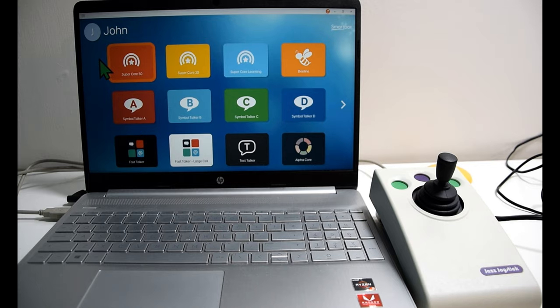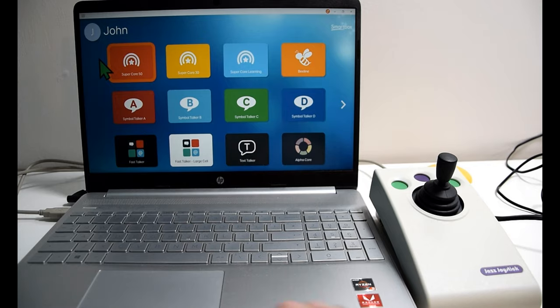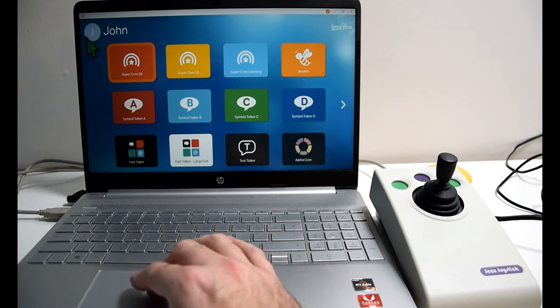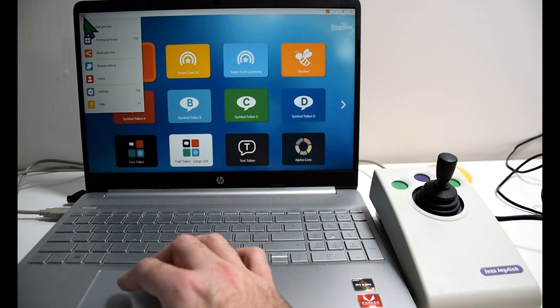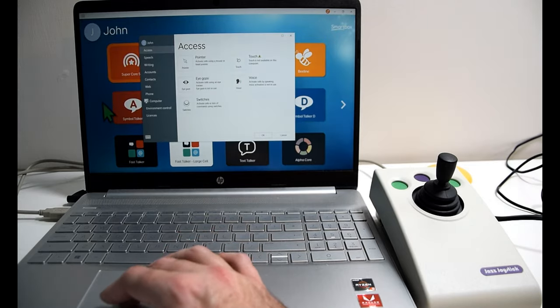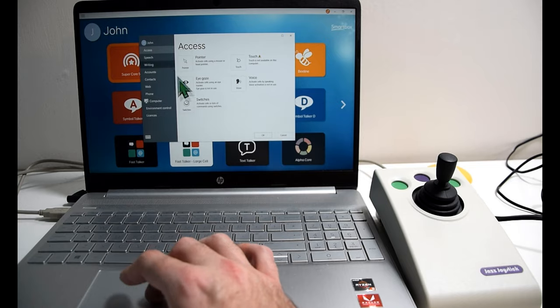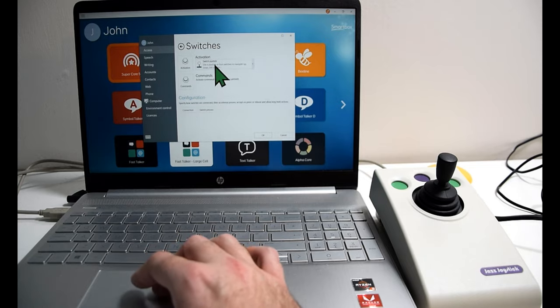We're in Grid 3, as you can see. You might be familiar with this already, but there are a few settings you need to double check first. Go into your settings and check your access part, then switches, and ensure that switches is turned on to switch joystick in the activation section.